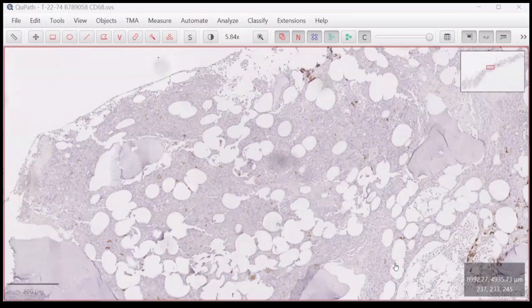So then you must think of the possibility that they are actually staining the immature erythroid, which you can confirm by having E-cadherin. So if some of this CD117 forms a 2-3 cell cluster, and you compare with E-cadherin, if they are similar to the E-cadherin pattern, then likely those CD117 actually belong to immature erythroid in post chemo.